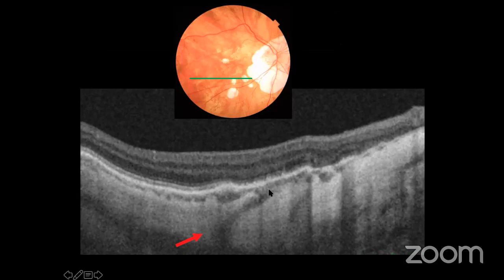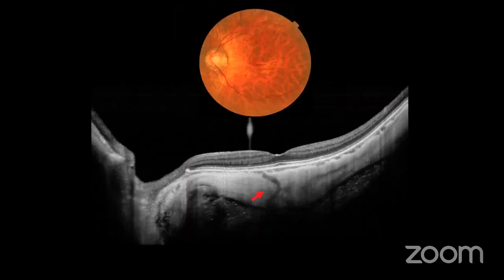Also, one change, if we analyze the images, this is thought to be like a perforating scleral vessel. Another case of a perforating scleral vessel, and these usually show well if the scans come across the area where the vessel perforated the sclera. That's why it's useful when imaging these eyes to do multiple cross scans, vertical and horizontal, to look for these changes.